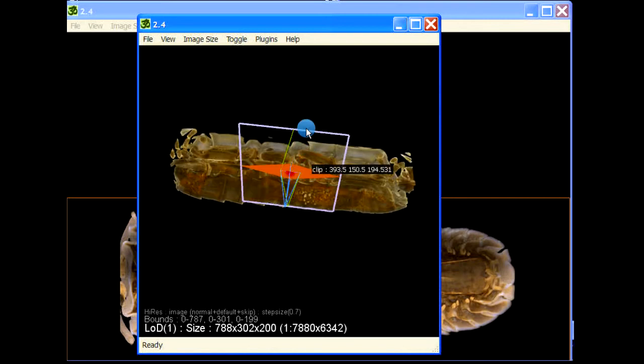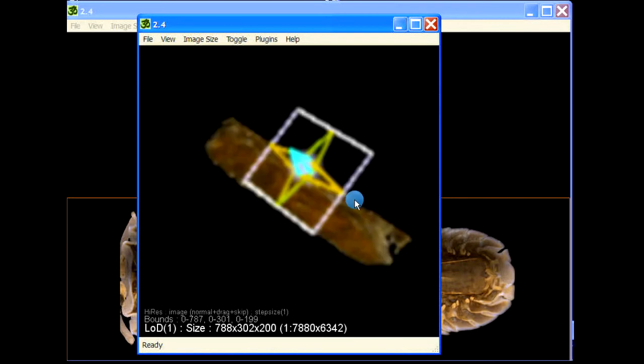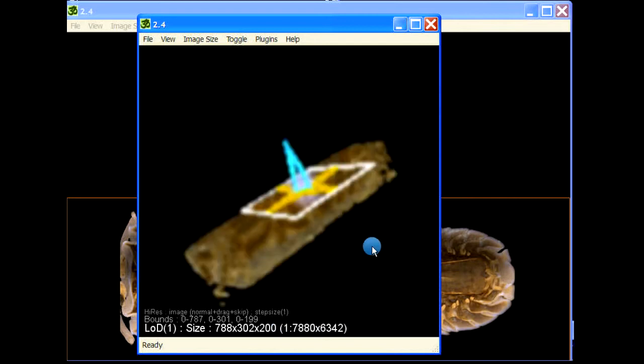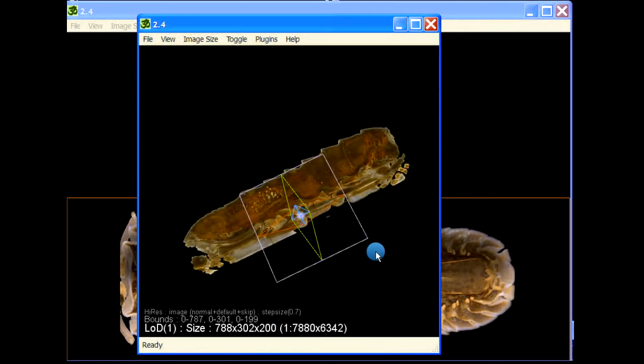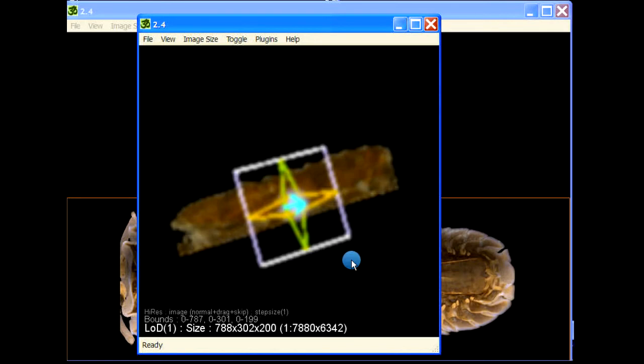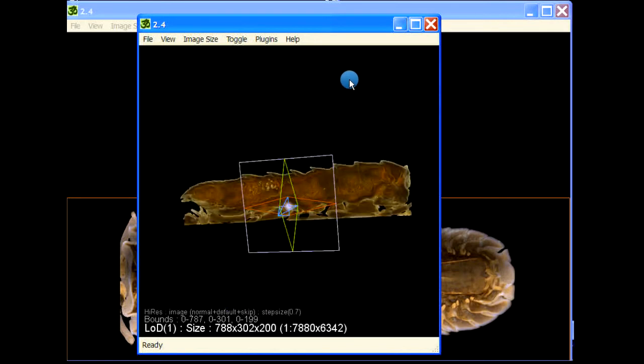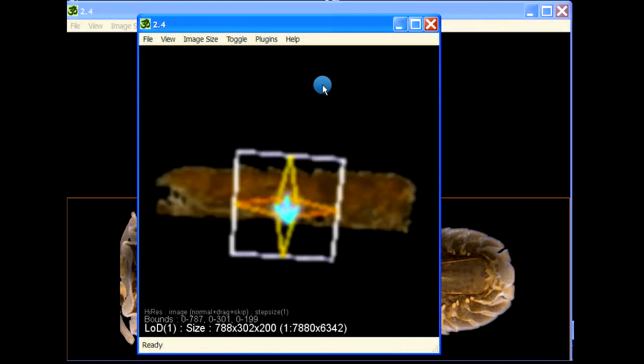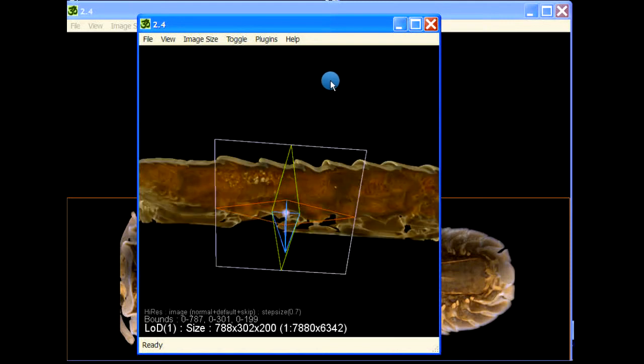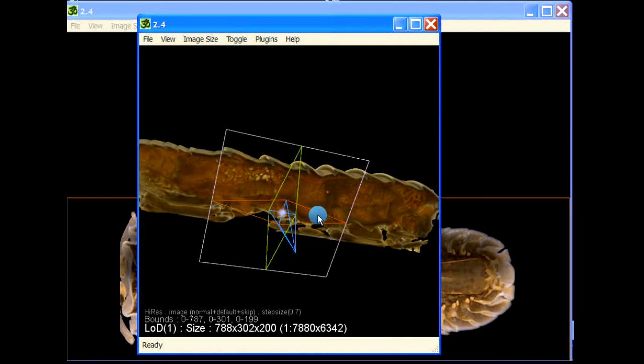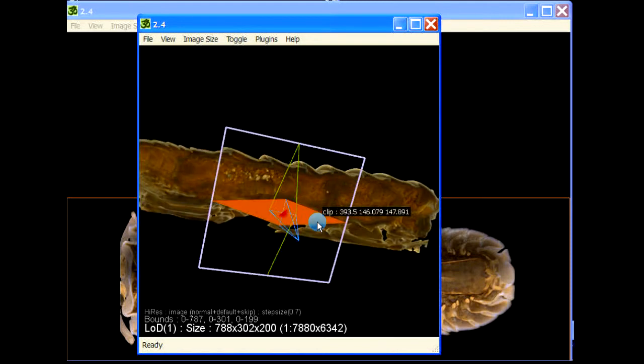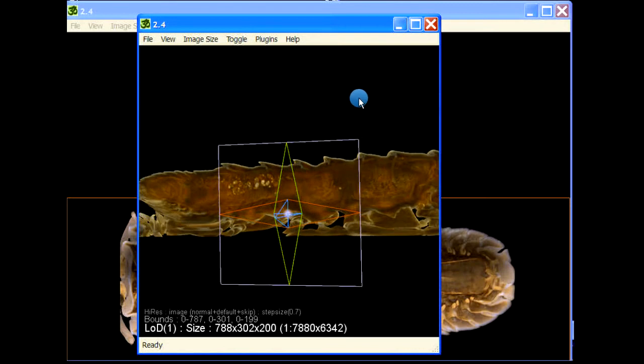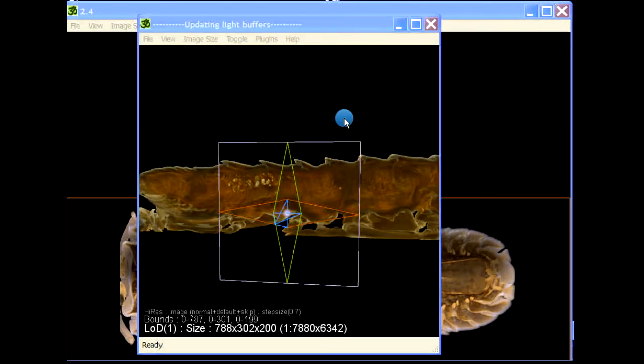When we did reslice full, it basically added the remaining part. The idea behind implementing that is sometimes you would put the path at the center of the feature that you want, and then you would like to save both the sides of the path spine. Then you would use the reslice full option.